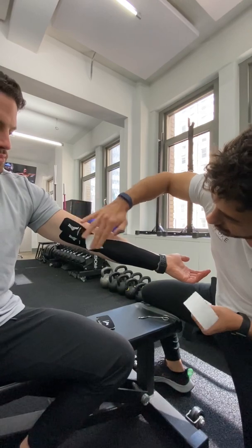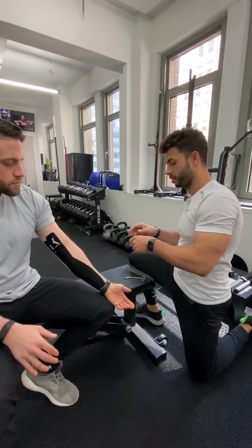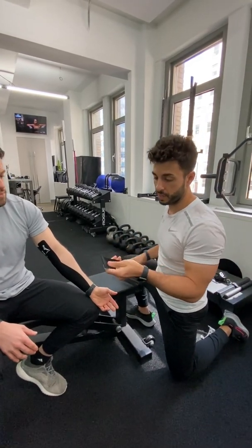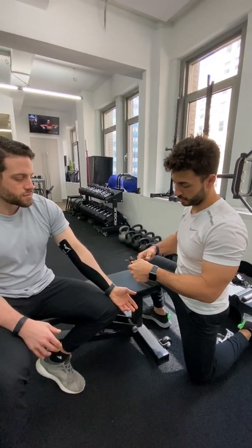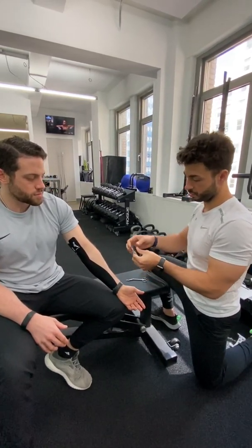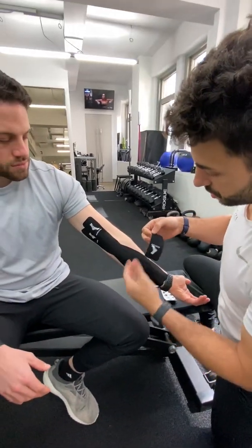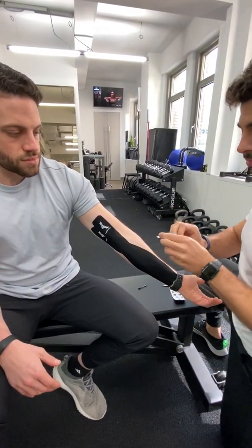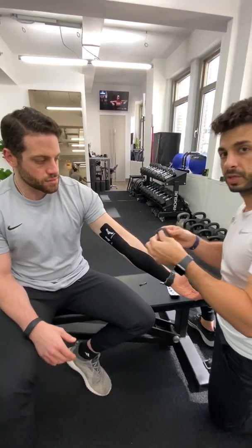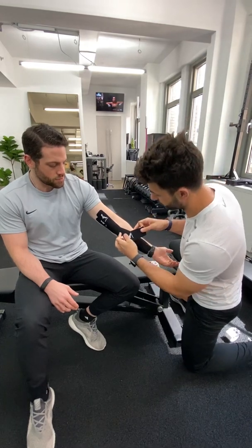Lastly, what I'm going to do is I'm actually going to cut this pre-cut strip. I'm going to round the corners so that it doesn't catch onto his clothing or anything to peel off — just round the corners, small little cut. And then what I'm going to do with him here is basically what we call a decompression strip. It's not actually decompressing, but it's actually just increasing the blood flow to the area and helping modulate the pain a little bit, giving him a little more tactile cue to get the pain out of there.